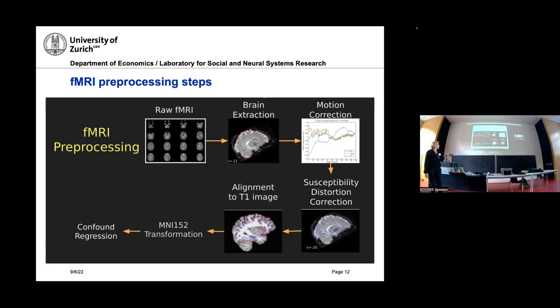And then there's one more step with this MNI 152, that mysterious wording. What you want to do at the end is, you always have your individual participants, but that doesn't help you, because you always need more participants. This is just the name of the template most people are taking to normalize the data. But again, a normalization from an individual to a template contains really heavy algorithms: we are stretching the data, warping the data, squeezing them onto some template, and this might fail. And then at the last step, we have these confounds with the physiology that we have to take out.